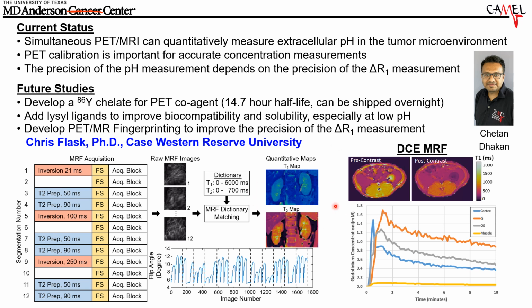And this is just a corollary experiment where we're doing DCE MR fingerprinting, because clearly the PET MRI that I've been showing is really a DCE MR method combined with the PET so we can track the contrast agent.